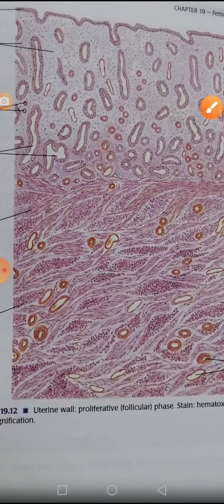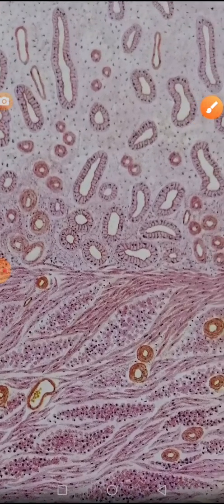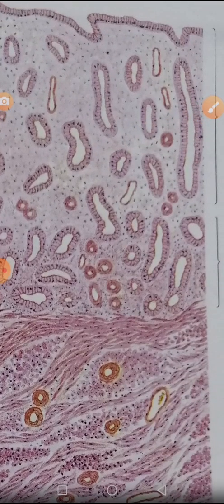And the endometrial glands are basically the invaginations of these lining epithelium, and you can see these invaginations over here, but you can also see them over here discontinuous or not in continuity with the lining epithelium. And the reason for this appearance is because this is a histological section, that is why they appear in this manner. Again, you can see plenty of these, right? And they're still lined by the same kind of lining epithelium, obviously.